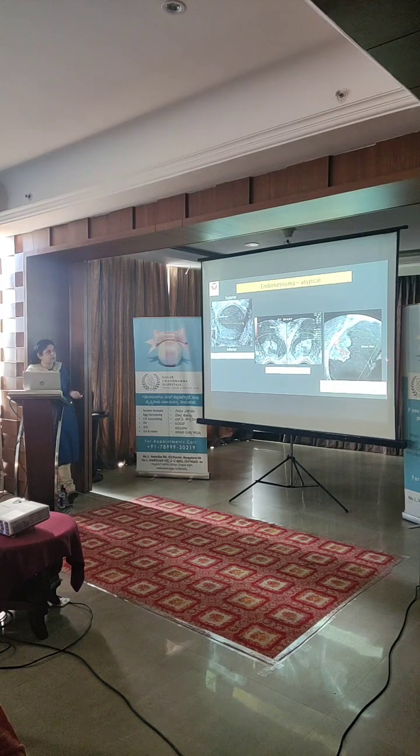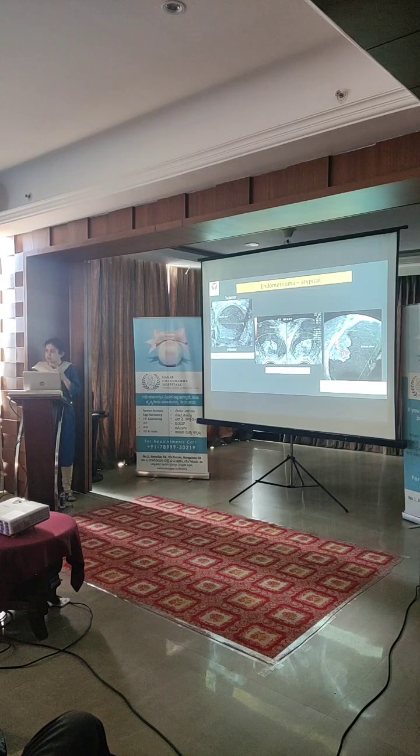She was operated with partial cystectomy. The report came as endometriosis. She came back to me 2-3 months later, and I found this lesion, and I realized that they had interrogated this with Doppler, but with improper settings, and they had missed a malignancy. So whenever you see a hyperechoic area within a cyst with ground glass contents, make sure that you assess it carefully with Doppler, but with proper settings.